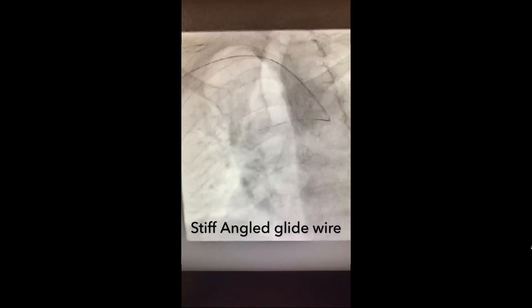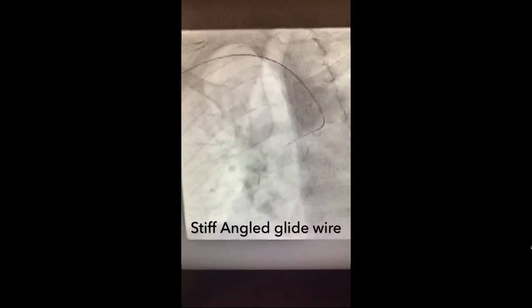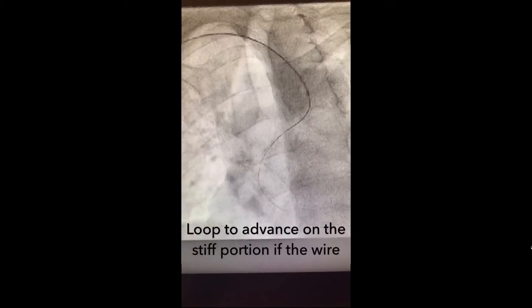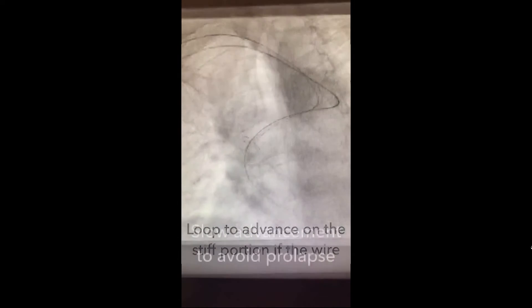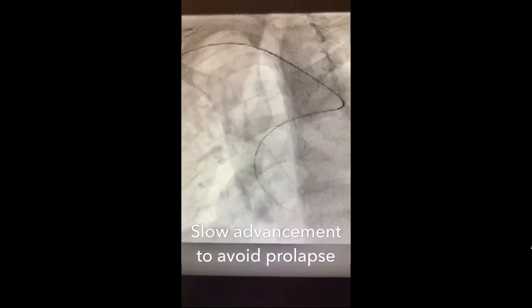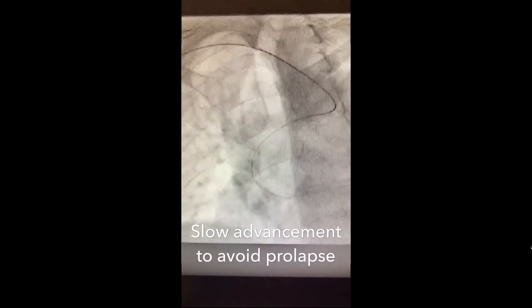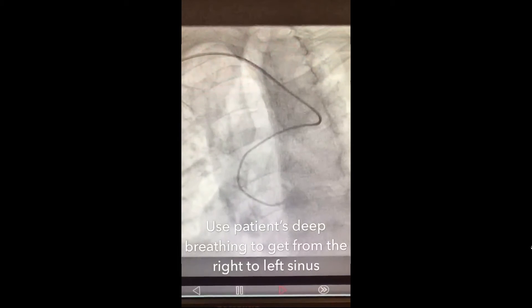We try to advance a stiff-angled glide wire slowly down to the aortic root and then form a big loop, over which the guiding catheter — preferably with hydrophilic coating — is advanced slowly in order to minimize the risk of prolapse.